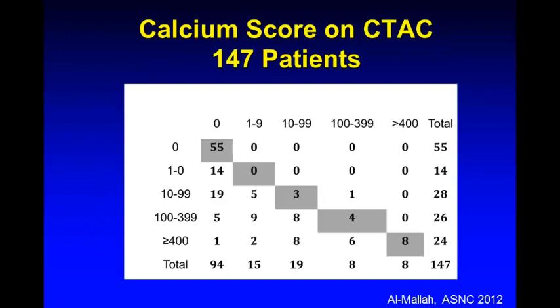Now, if you have a CT attenuation correction, can you use that CT attenuation correction to get a calcium score? There is conflicting data in the literature. We did a study looking at this in nearly 150 patients.